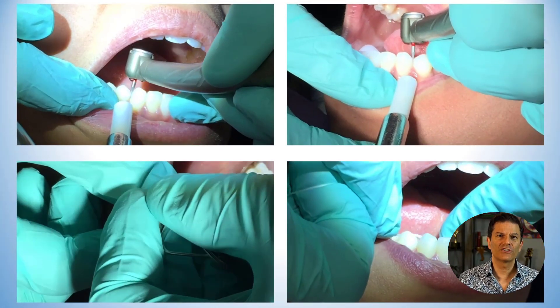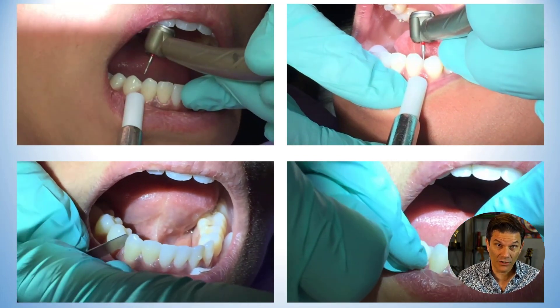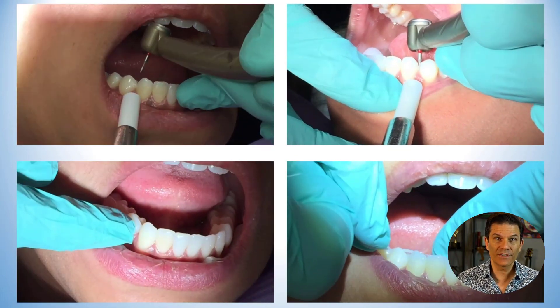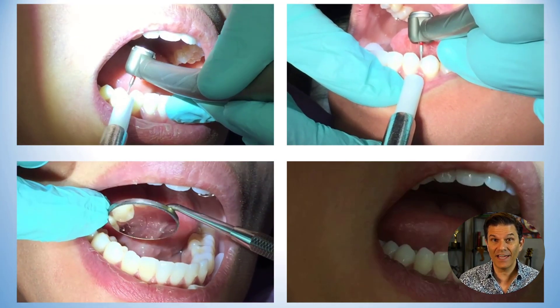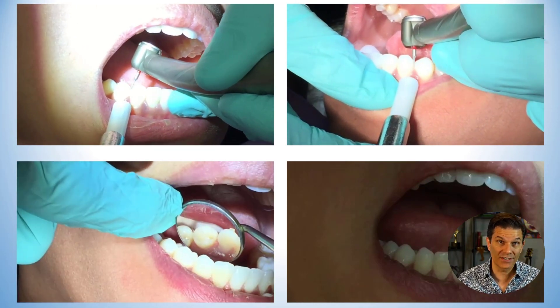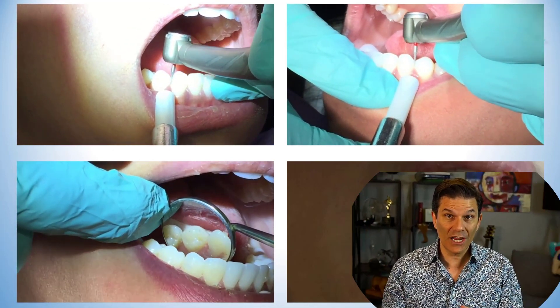When they started to bond brackets on teeth instead of using complete bands on all teeth, the interproximal surfaces became accessible. So the idea of taking advantage of the enamel thickness on these surfaces to reduce and reshape them became more and more popular.